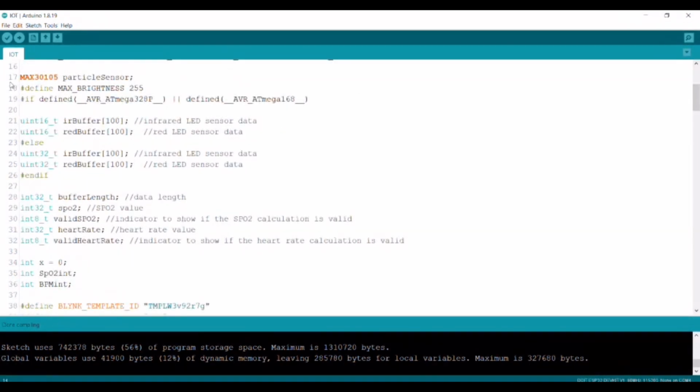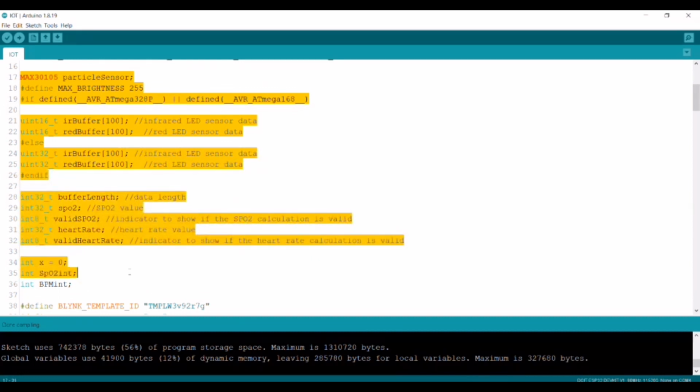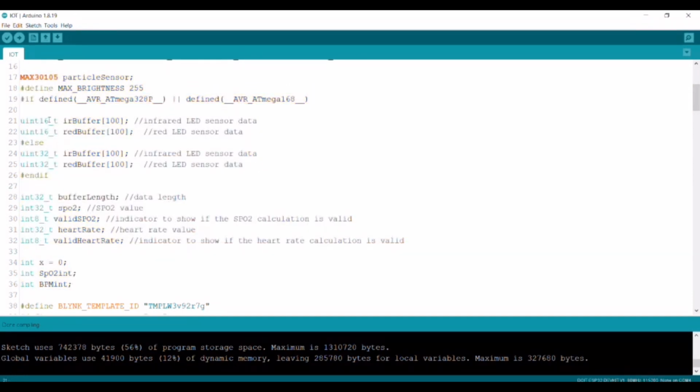And as the Arduino Uno doesn't have enough RAM to store 100 samples of the IR LED data and the red LED data in 32-bit format, we need to change it into 16-bit data here.